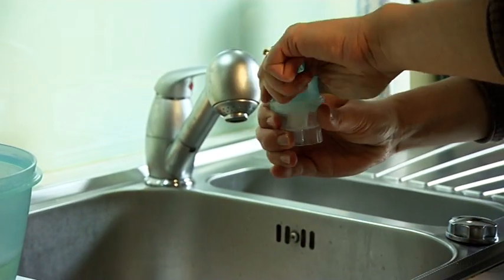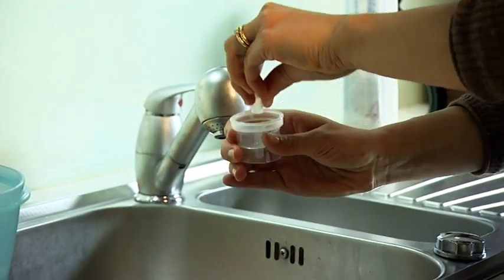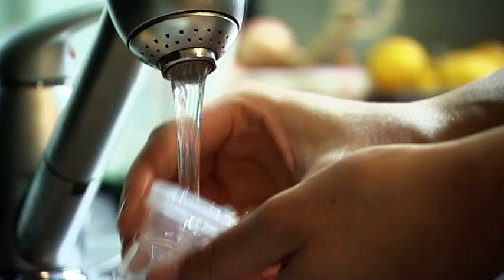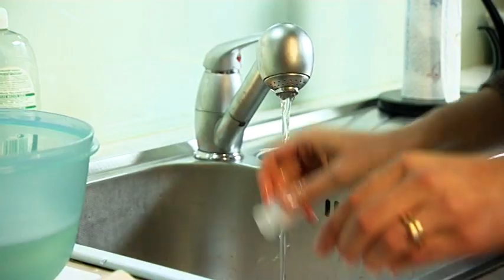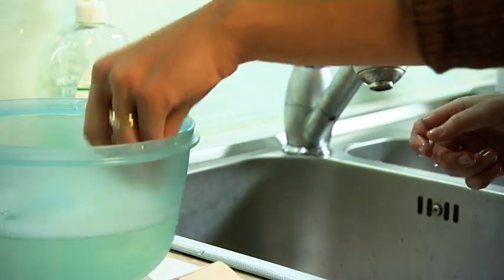Dismantle it into four parts. Do not forget the jet. A small amount of medicine remains in the bottom of the tank. Empty it out. Rinse all the parts under running water, then wash them in a container with water and a few drops of dishwashing liquid. Rinsing the tubes is usually not necessary, unless some liquid remains inside of them.